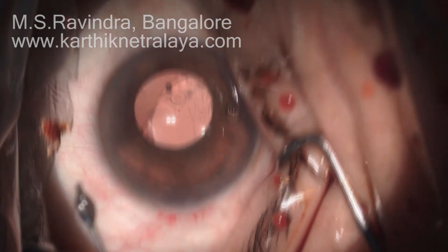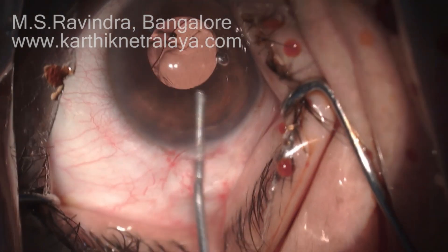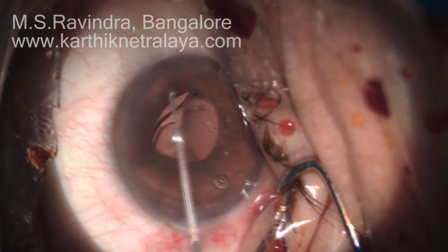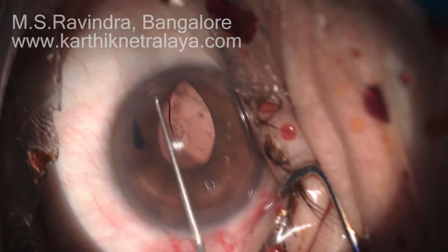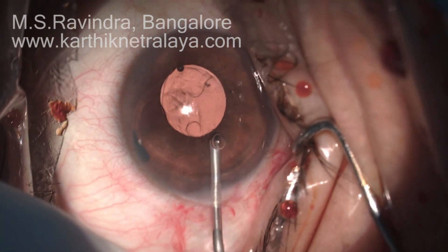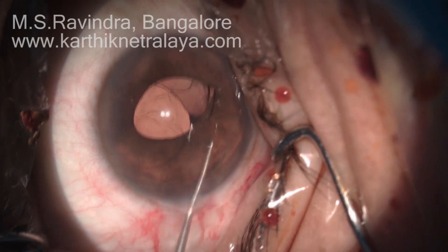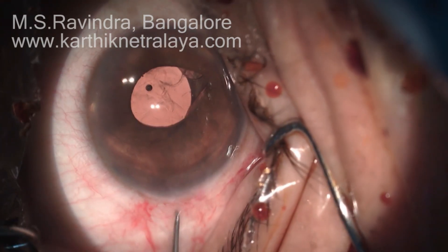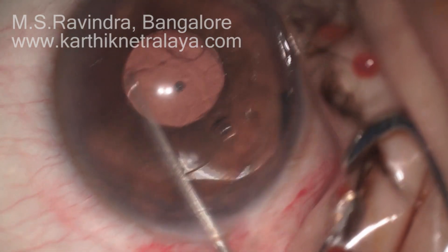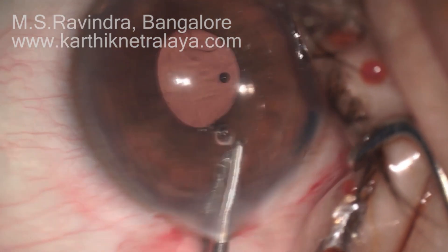1% lignocaine into the anterior chamber is used for topical anesthesia. The lens is rotated into the anterior chamber under the protection of viscoelastic — this is a PC lens being brought into the anterior chamber. There is no vitreous in the vicinity because of the vitrectomy during the primary surgery. Repeated injection of viscoelastic is very important. Take your time, pull both haptics out of the posterior chamber into the anterior chamber, bring the lens in line with the tunnel, and then explant it by holding with the lens-holding forceps — a Kelman forceps is of no use here.